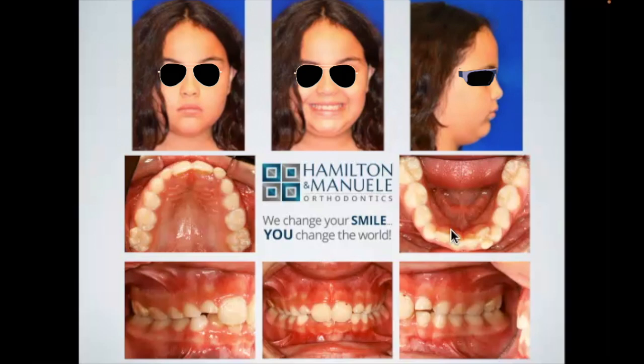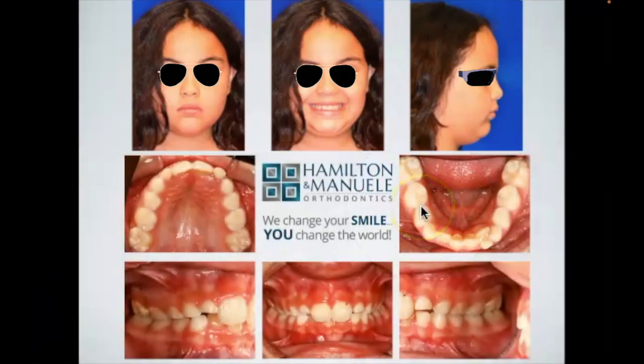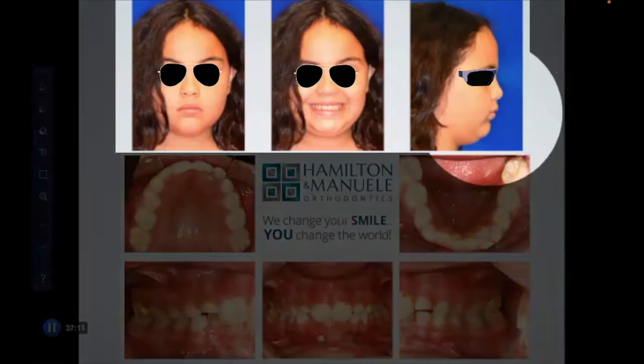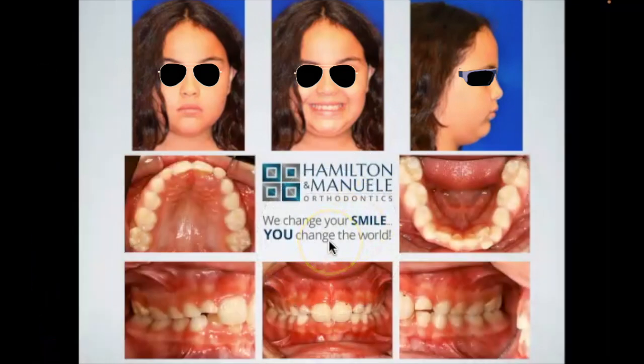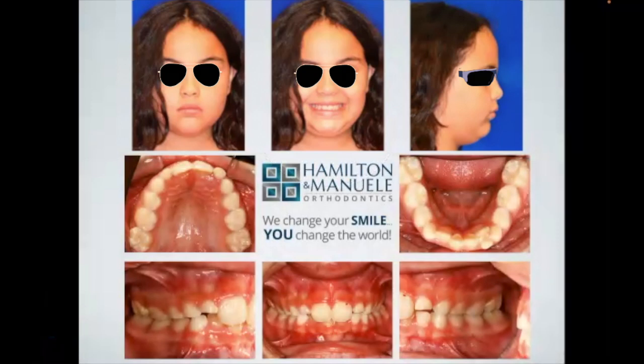All right, what about our crowding and buccal corridors and what we didn't talk too much about, the slight tipping in of these lower teeth? And we'll go through some x-rays to look at it in more detail, but what might you be thinking for that? Okay, you might want to do expansion, right? We make the upper jaw wider. If anything, that helps our buccal corridors. Upper jaw might come down and forward. Doesn't really need to come forward too much. Talking about the nasolabial angle, that looks pretty normal. Lower jaw does seem a little bit more recessed, but certainly coming down a little bit is not going to hurt the smile show. If anything, it might help it.